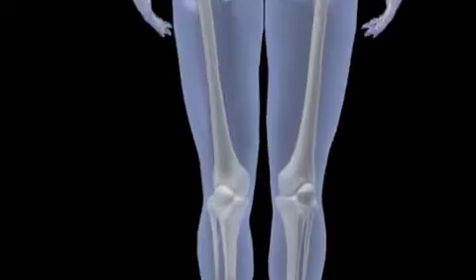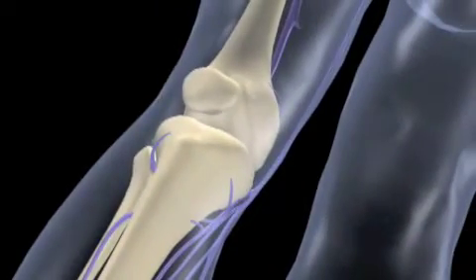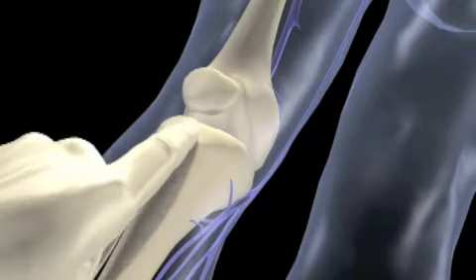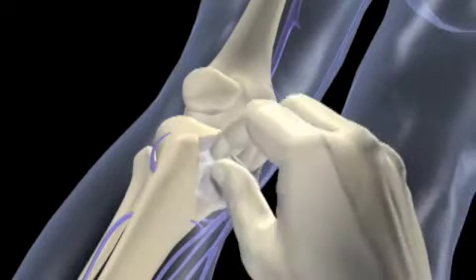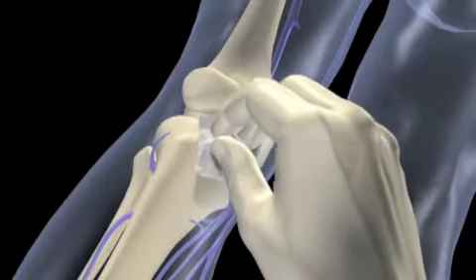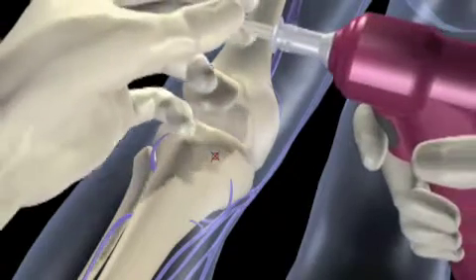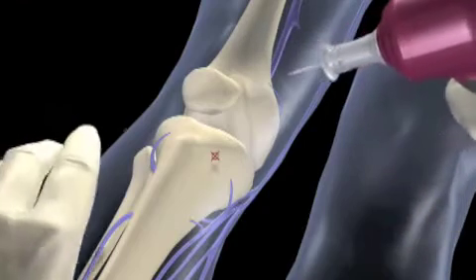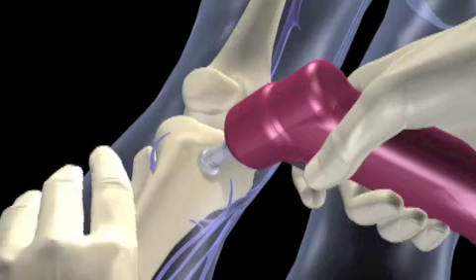Okay, we're going to zoom in here on the proximal tibial insertion site. That's the normal site, just like with PALS. We identify the patella, we find the tibial tuberosity, and then we move in one-fingered width medially, or to the inside. We're going to prep the area with all the materials that are contained in the kit that we're going to be carrying. Uncap the drill bit that's been attached to our drill, or we attach it to the drill, of course. It won't come that way. And then you drill in and it goes in about that easily, and it disconnects.